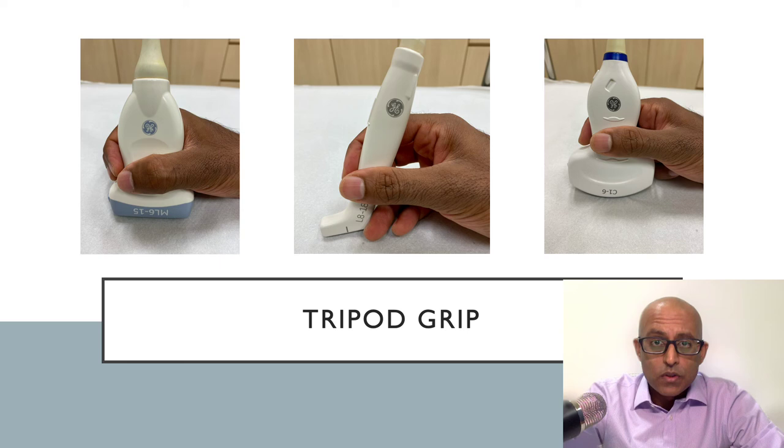This grip can be used for all types of transducer. We can see here that I'm demonstrating it on the linear, the hockey stick, and the curvilinear transducer. By doing so, you're going to confer a lot more stability to your images, you're going to be able to follow structures more easily, and you're going to get better images overall.